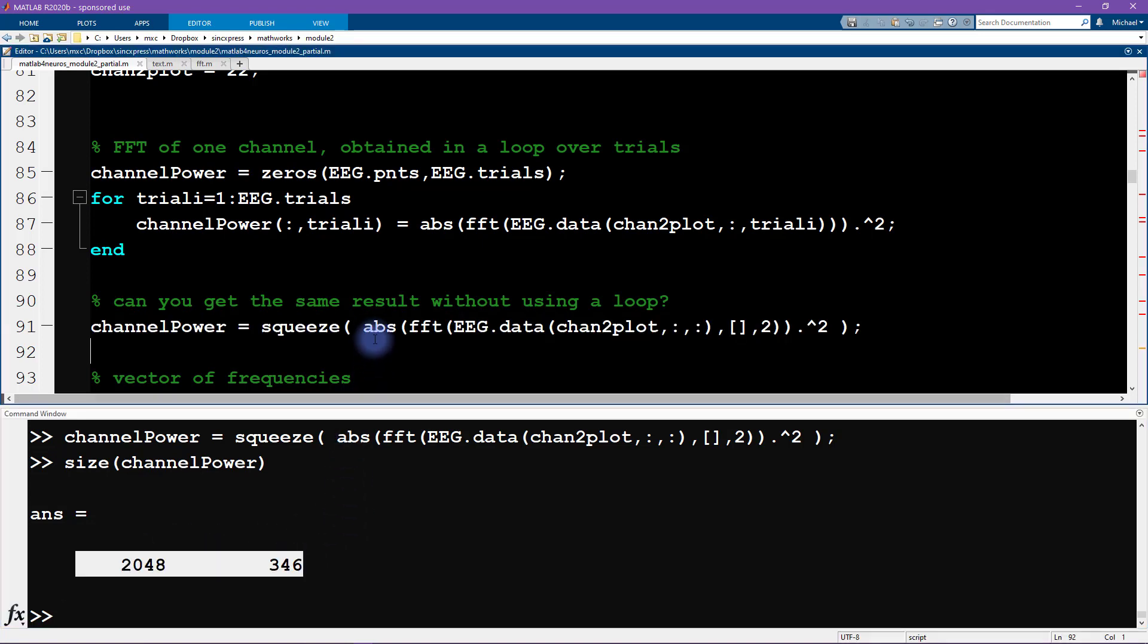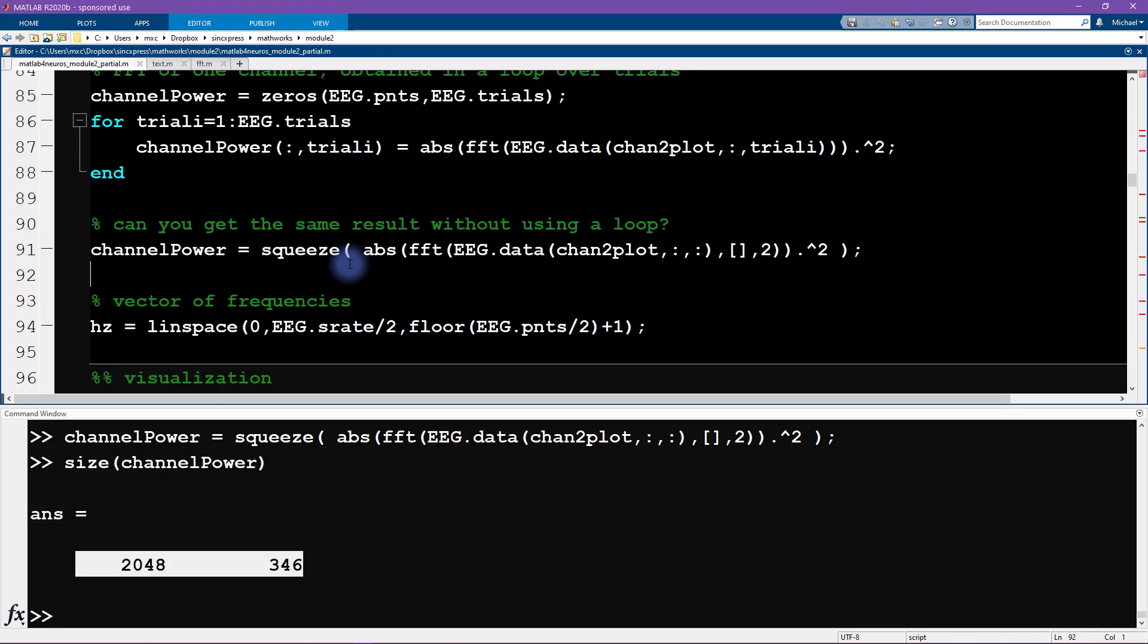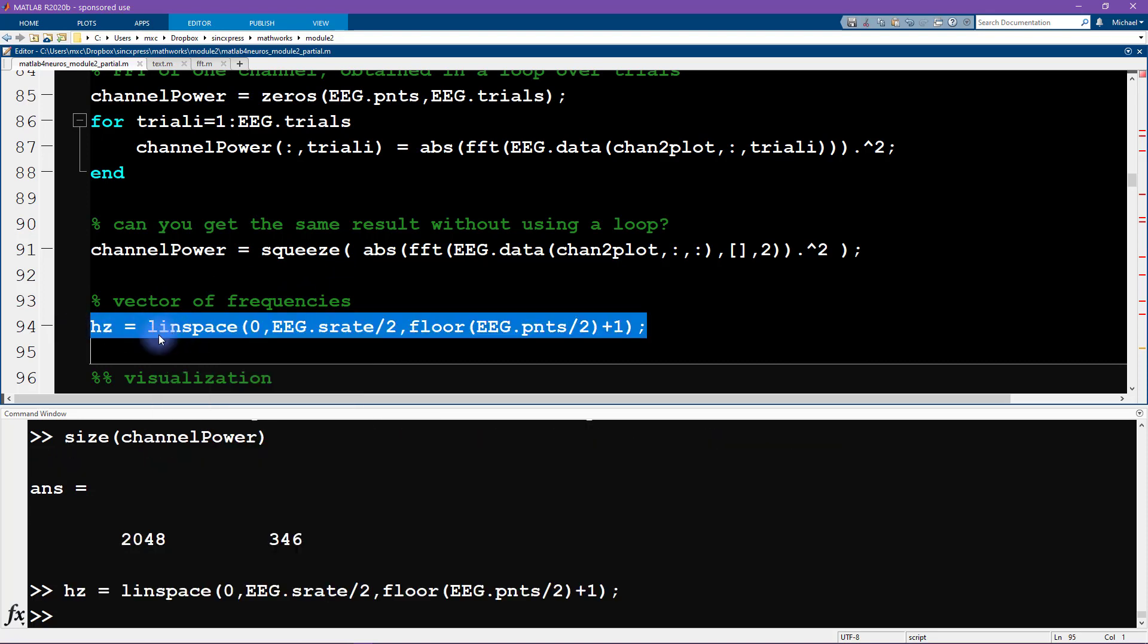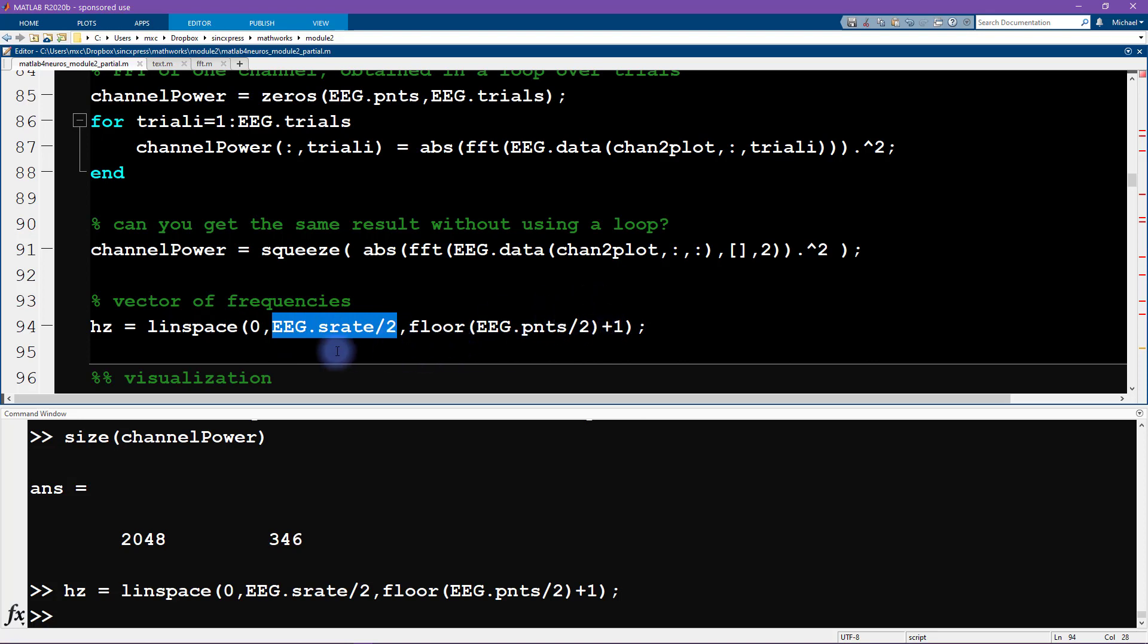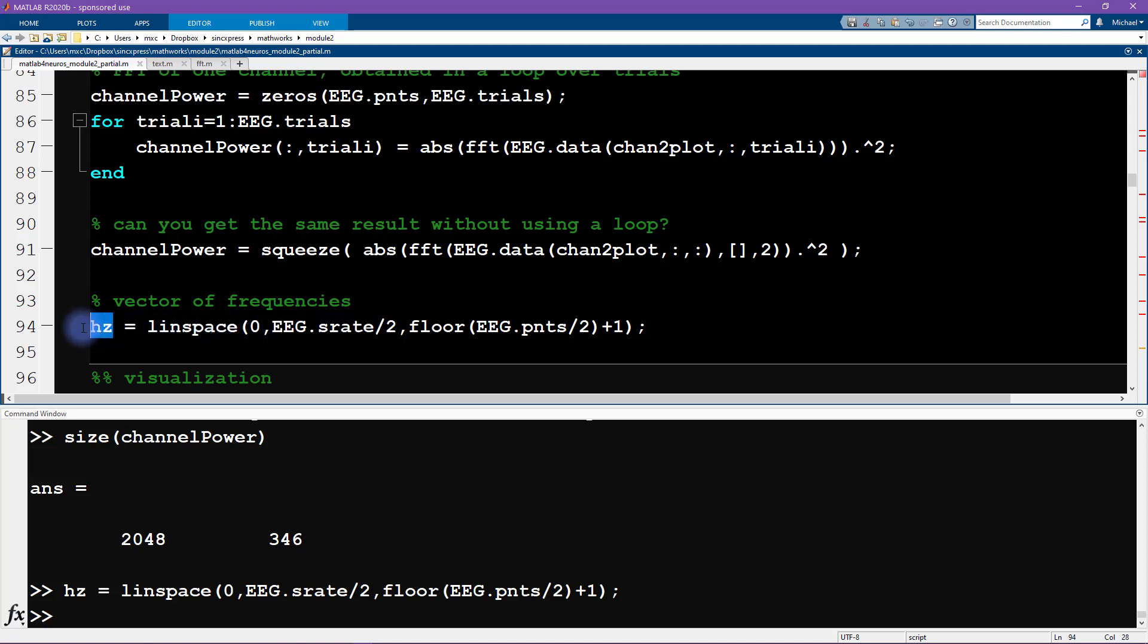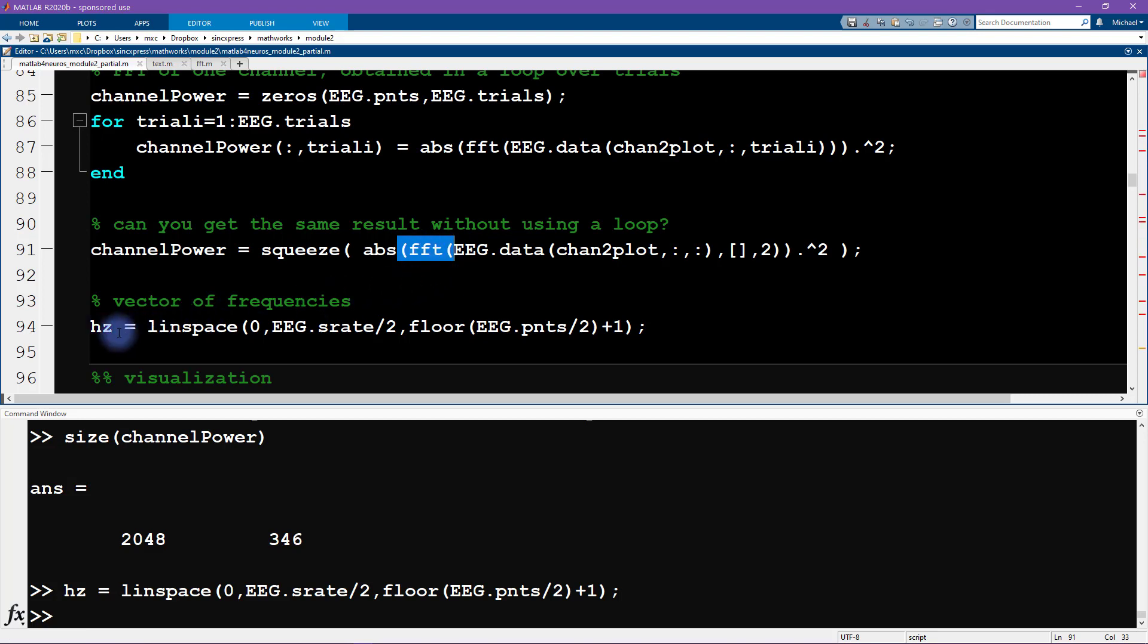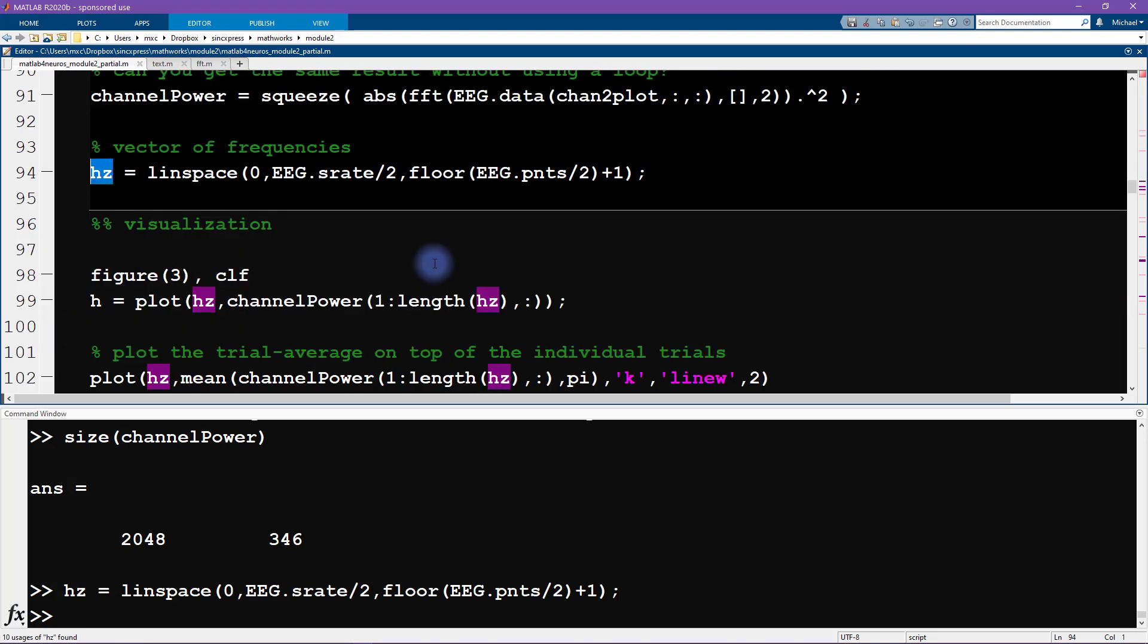As I mentioned in the first video of this module, the Fourier transform is a really rich operation with a lot of details. One of those details is the way that you define the vector of frequencies. The short version is that it goes from zero to the Nyquist frequency, which is half the sampling rate in n over two plus one steps. This allows us to map arbitrary frequencies that are the output of the Fourier transform into meaningful frequencies of hertz.